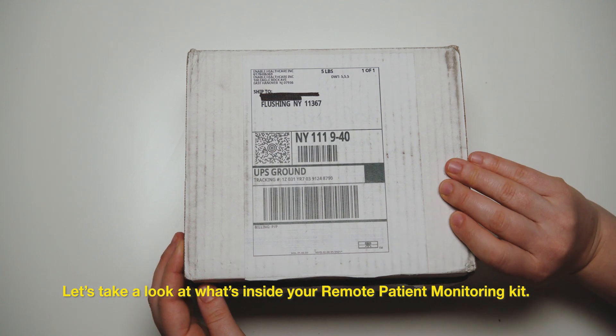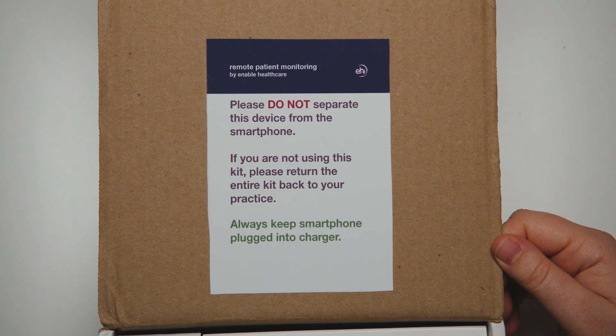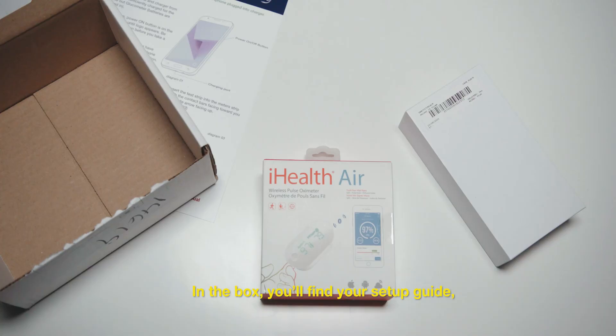Let's take a look at what's inside your remote patient monitoring kit. In the box, you'll find your setup guide, your medical device, and a smartphone.